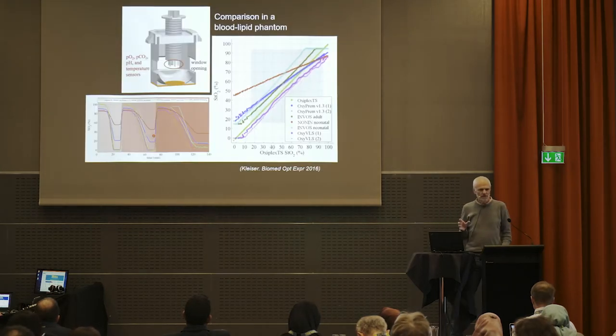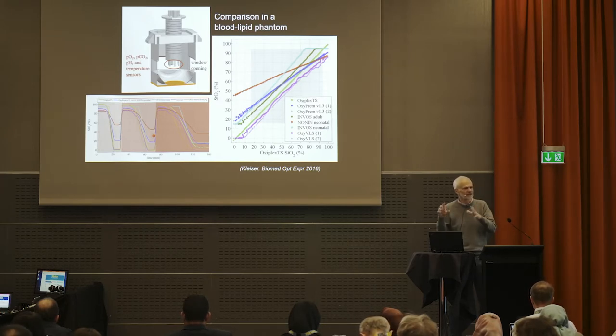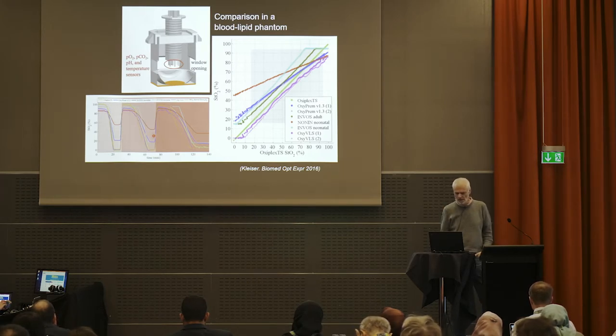And then we will use these oximeters which are available on the market, and those approved for clinical use. So it won't be a device trial. It is not a trial of a device. It's a trial of a way of treating patients. So it's comparing two different ways, or two different policies, of treating babies. And that requires that we know how these are working, and the problem is they don't all work the same.